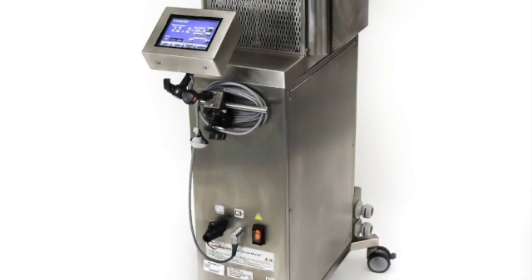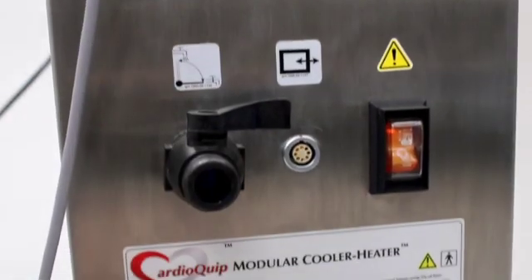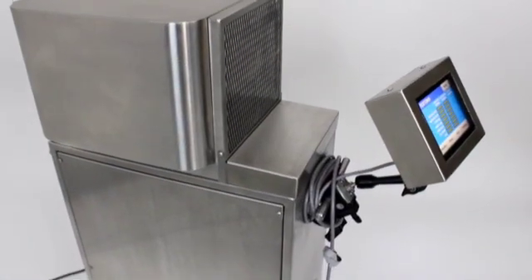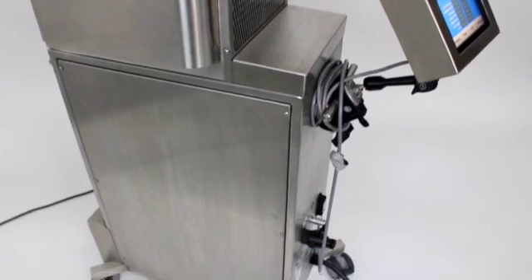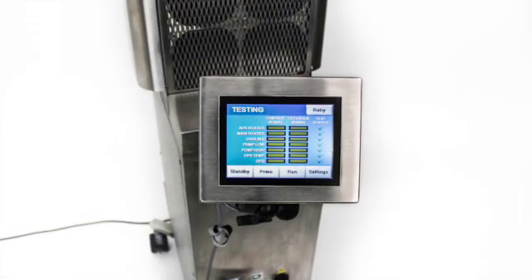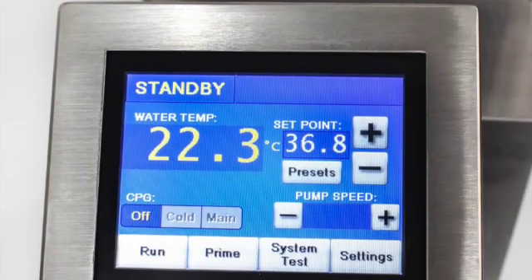Today, we are highlighting the Cardioquip MCH1000i Modular Heater Cooler. The MCH1000i has superior cooler heater performance, with user-friendly features like a digital touchscreen, precision temperature control, and modular customization.